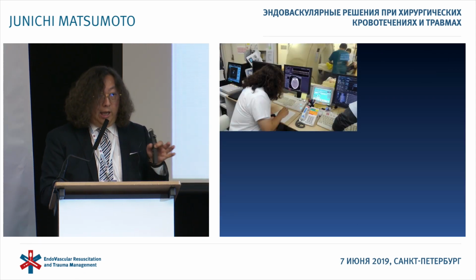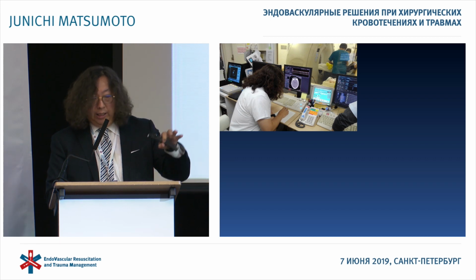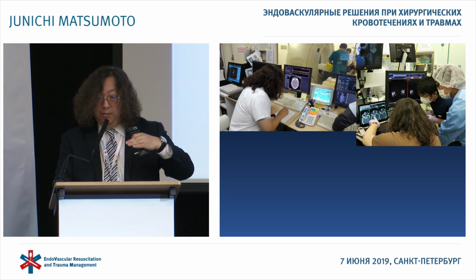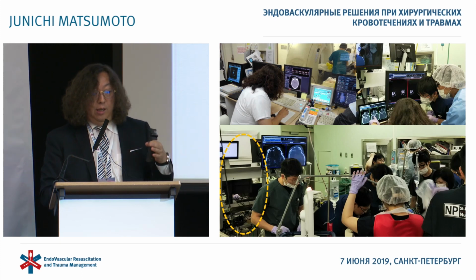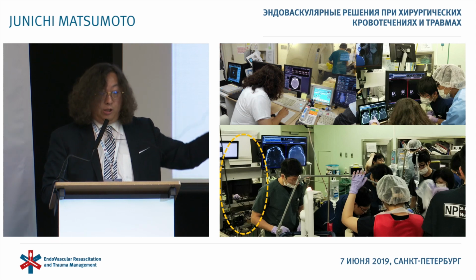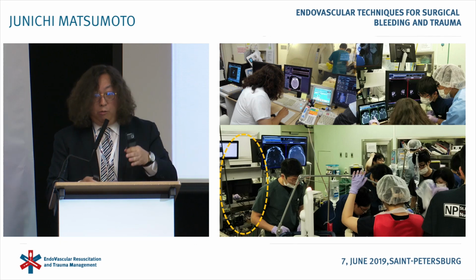And again, it is also very important to have someone keep reading images during a CT scan and right after the CT examination in the ER. The yellow dotted circle is indicating me reading behind the screen. I show the images to them, but no one looks at the images.